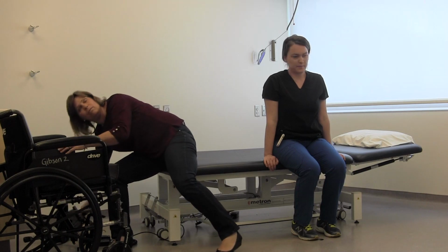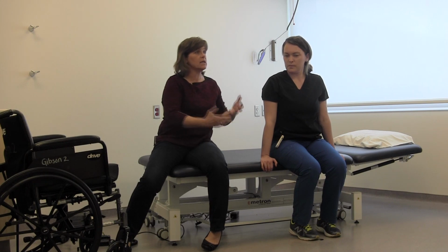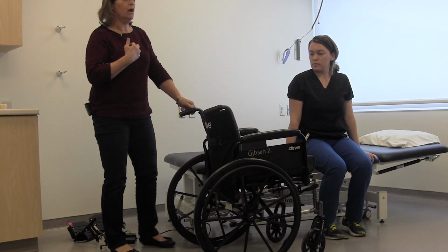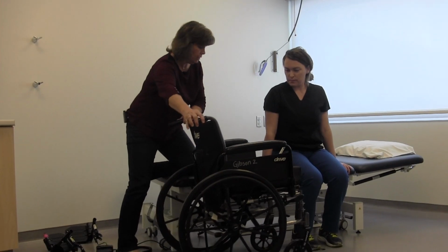And we're going to do what I consider to be a moderate assist transfer, meaning that the patient can do about 50% of the task, and I need to do about 50% of the task. So we bring the chair in, and because I'm doing it by myself, I want the chair as close to the bed as possible with her, okay?